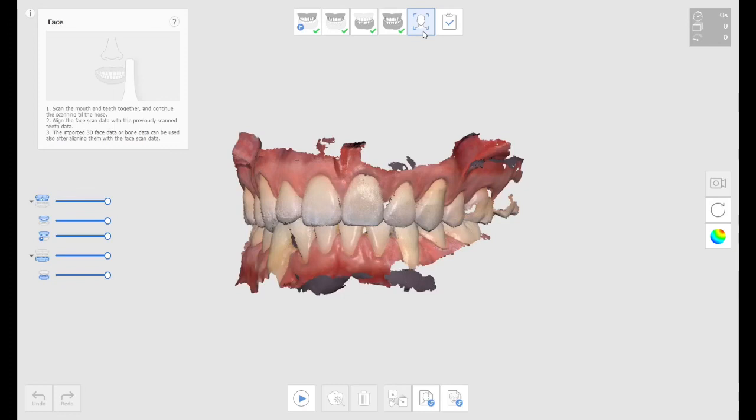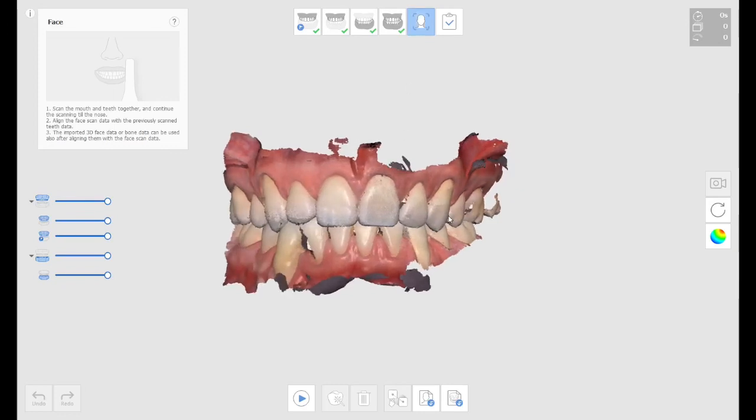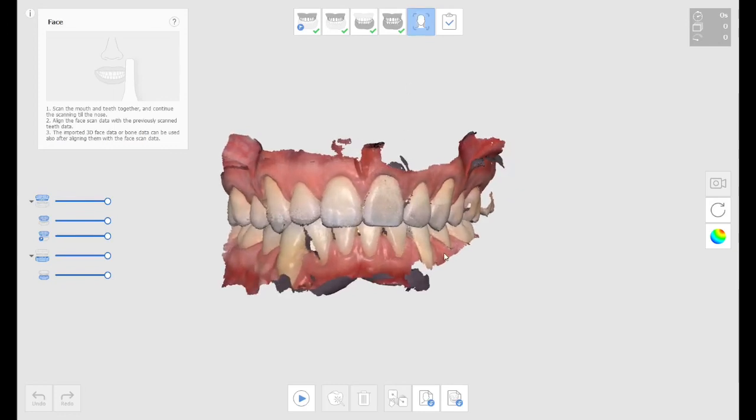So basically, with this new functionality of face scan, which I don't really use a lot of face scans, but the reality is you can scan pretty much everything.